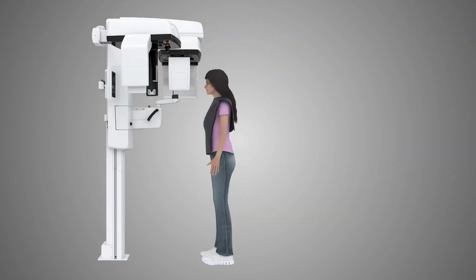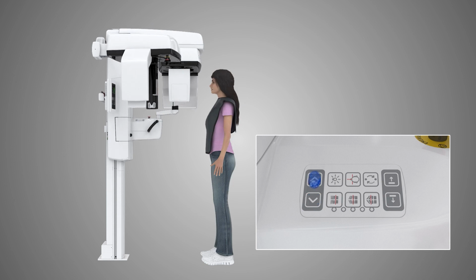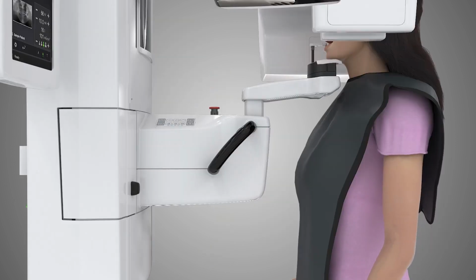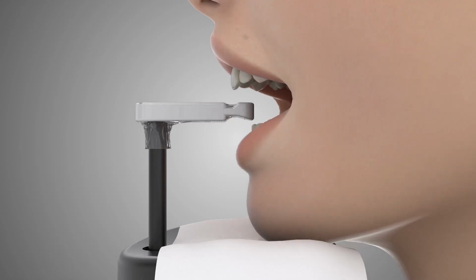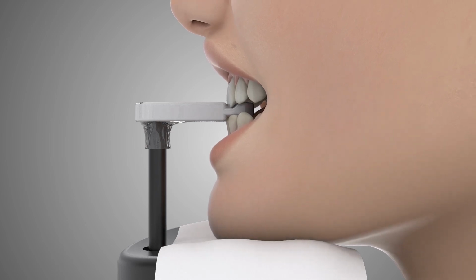Instruct the patient to stand as straight and tall as possible in front of the unit for preliminary alignment. Adjust the unit's height so it is slightly higher than the patient's chin using the up-down arrows on the positioning panel. Ask the patient to grasp low on the patient handles and bite on the bite block so that both the upper and lower anterior teeth are in the grooves of the bite block.